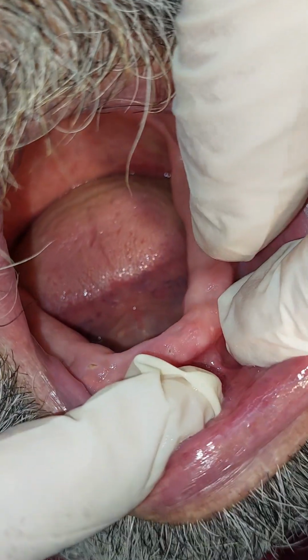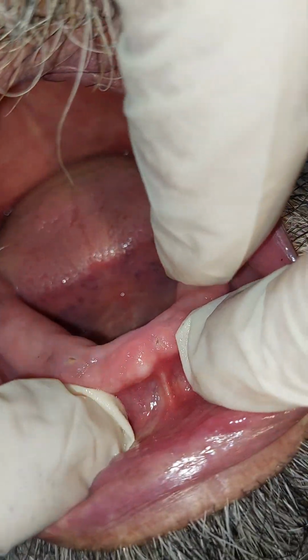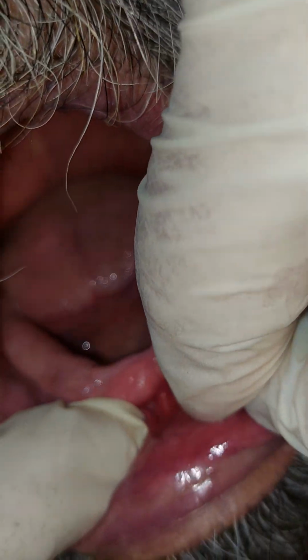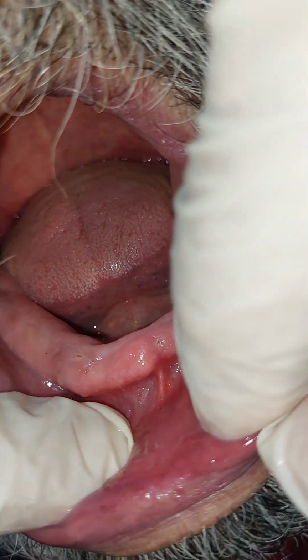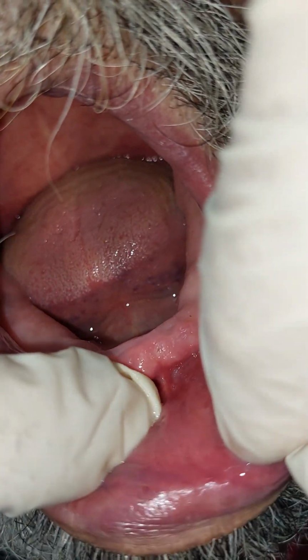So I will not let the denture enter all into the undercut. I'll let it enter smoothly into the undercut. I will not let it go under the shelf immediately, like these areas. I would make it smooth, running over the bulge of the crest to the sulcus.